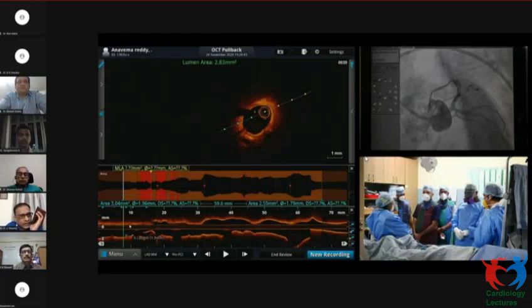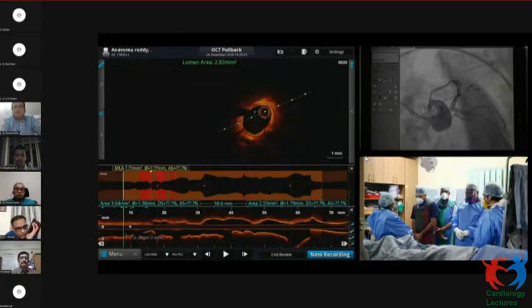We saw only one shot of the angiogram. Yeah. The LAD diagonal part seems to have a small intramyocardial segment there. That was just after the diagonal, just after the LAD D1 bifurcation, a small intramyocardial segment.